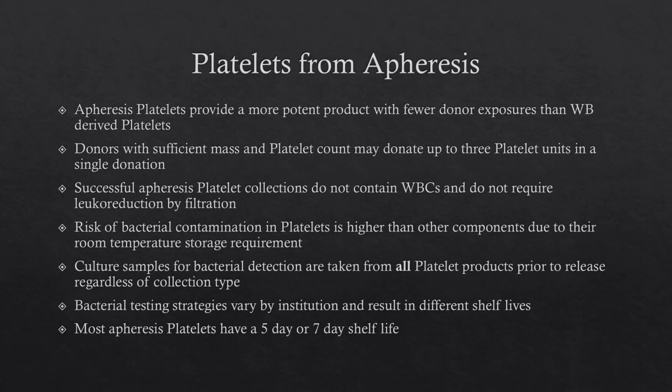If the collection goes as planned, the platelet component will not contain WBCs. Platelet components, we do want them to be leukoreduced, but this is not done by filtration. It's actually a part of the collection, and the platelets are separated without getting into the buffy coat layer. We don't get into the WBCs during a successful apheresis procedure, so you get a good WBC-free platelet component.